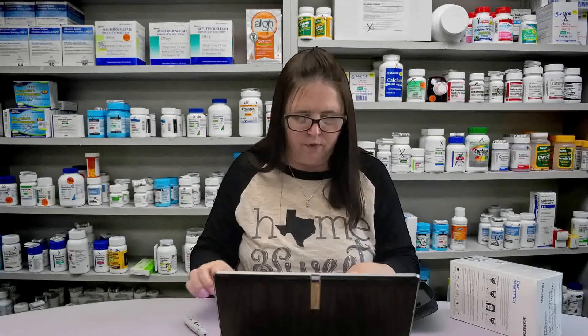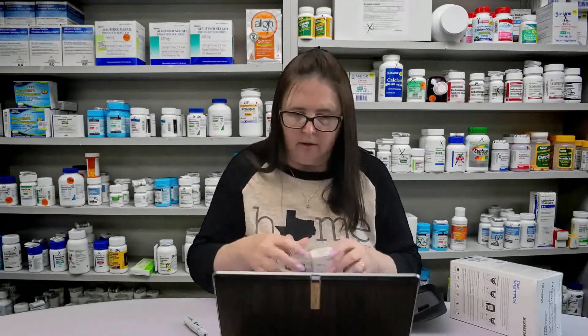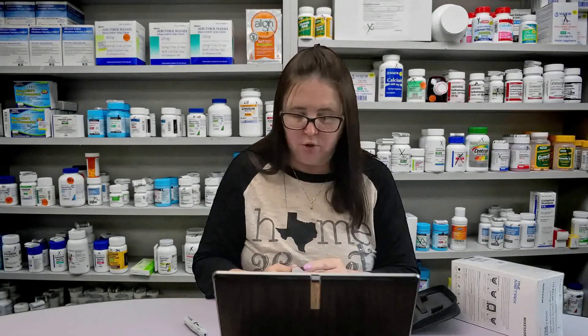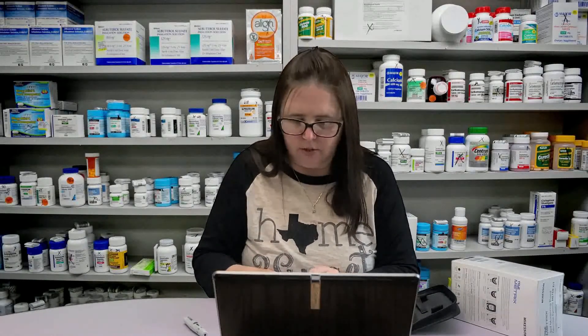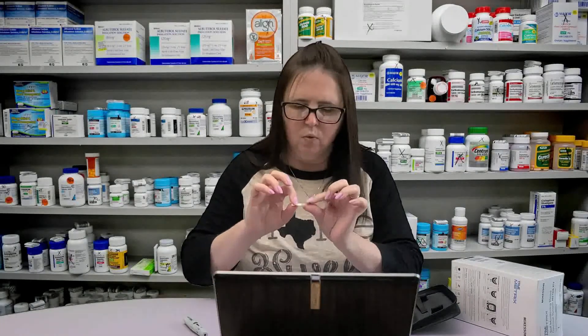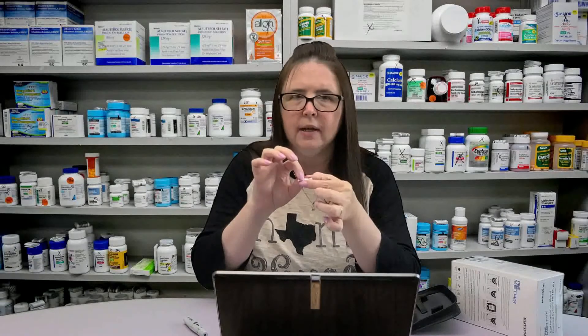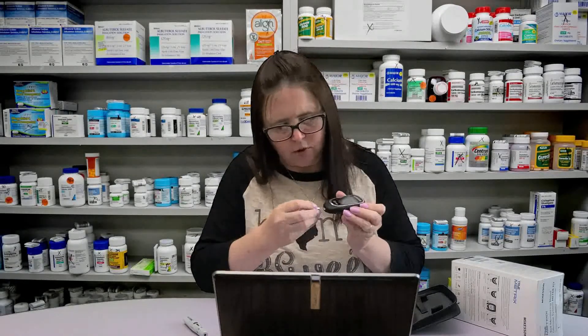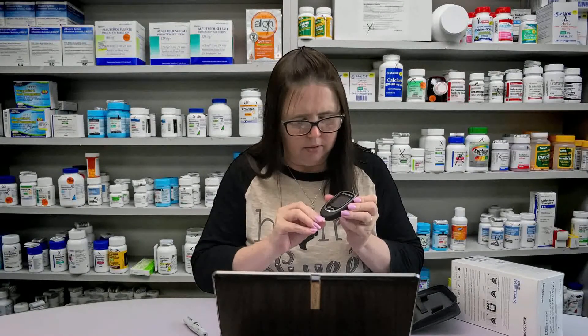I have extra test strips here that I'm going to use so I don't get into your supply. We're going to remove one of the test strips from the vial — you want to close it immediately and make sure to use that strip fairly quickly after removing it in order to receive an accurate reading. You cannot reuse a test strip. On one end of the strip there are black blocks, and the other end is what you're going to stick into the blood. With your meter off, you're going to stick your test strip into that little port and it will automatically come on.